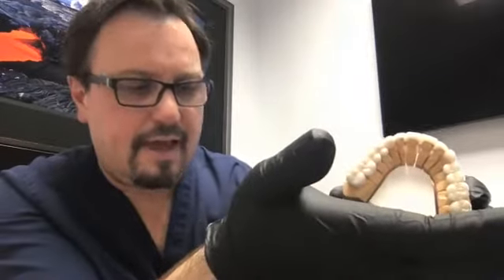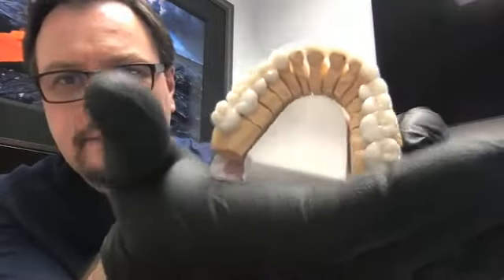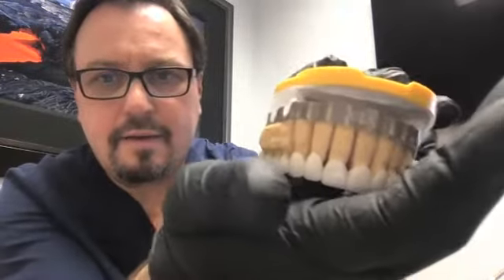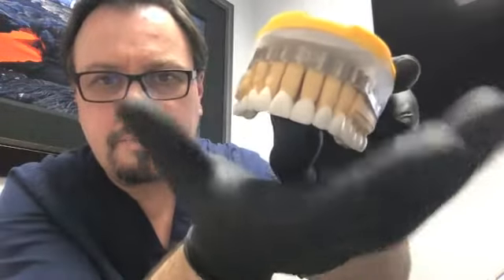The final restorations are a combination of two materials. I've got them here. That's why I'm wearing the black gloves. Let me show you them. I'm going to put my hand under this so I don't drop these, but I have a table that's covered with velvet in case they drop, so that's soft. But here's the upper rehab. I'll put it right there so you can see this. Now, let me just put it like this so you can see. What I'll do is try to take some pictures of this after and post them in the comments below so you can see this better.